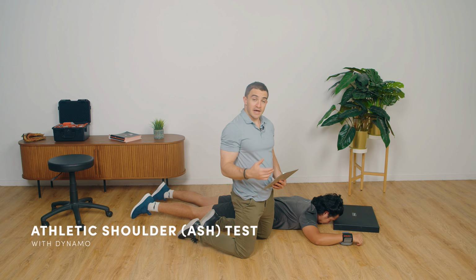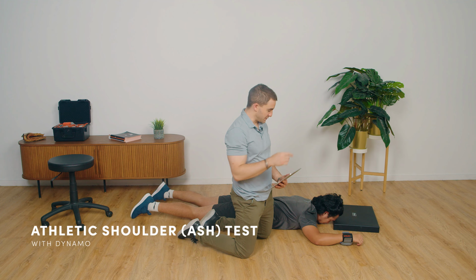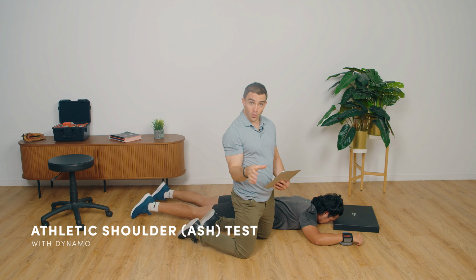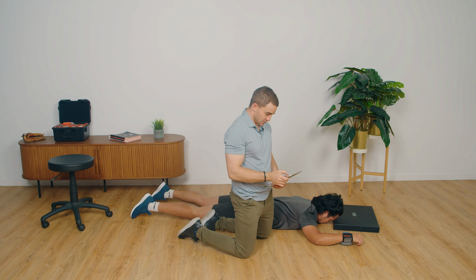So if I want to perform the ASH test using the Dynamo, it's actually a little bit quicker and easier to perform than it is using ForceDecks because I don't have to rearrange the patient or the force plates. I can just simply move their arm into a different position, and I can use the test battery features, which allows me to run through the tests really, really quickly in succession. So I'll just bring up Cal's profile, and what we'll do is we'll just run it through one side.